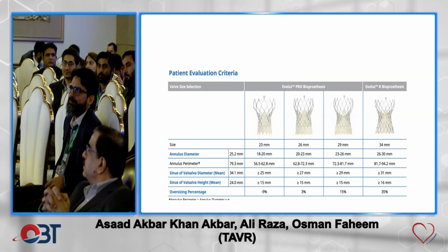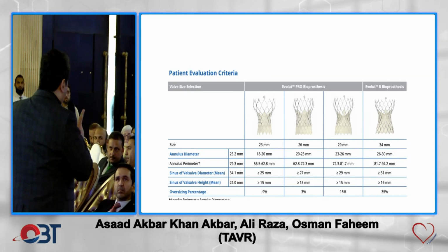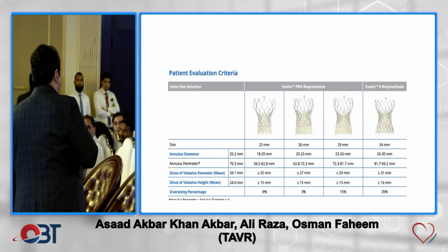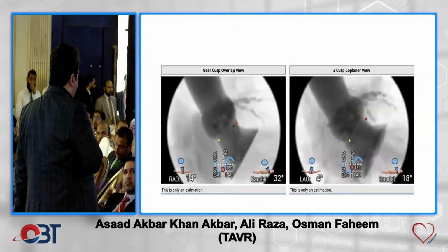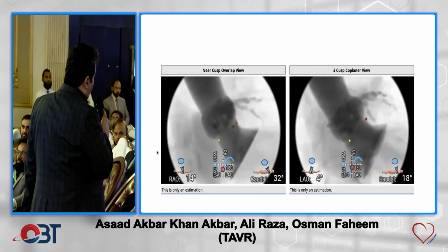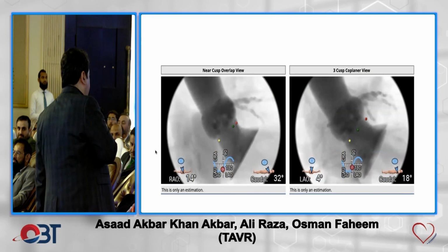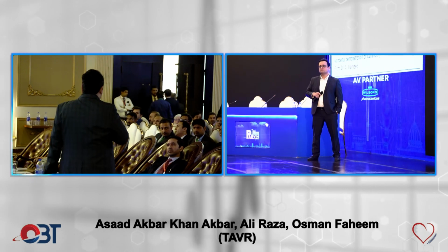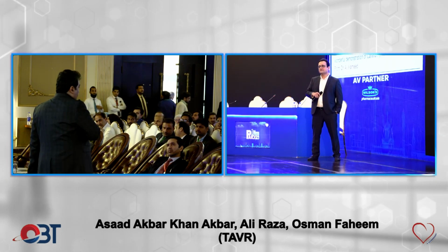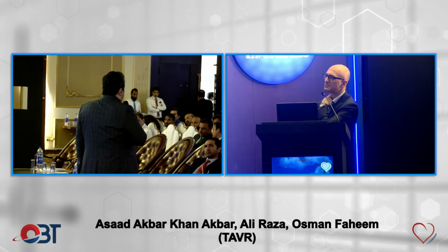Now, the question is where you're going to deploy this valve. For bicuspids, I deploy very high actually, even at -1 probably. If I don't have to post-dilate and I make my mind before that, then I size according to that. If I'm going down to the annulus and I'm going to deploy it a bit deep, I'm not sure, that's a very difficult question. Then I think it will depend on how my mood is that day. So for a higher implant, I will still go with intercommissural distance. And I will deploy it higher actually, because this will never reach the annulus. I personally think, I might not be that right, I don't have any evidence for it. Bicuspids, like you said, it's a different ball game altogether. Their contact with the annulus is not that much actually, because this valve does not even open that much.